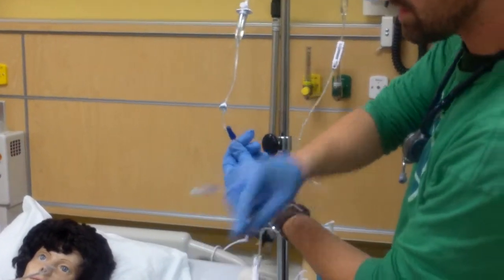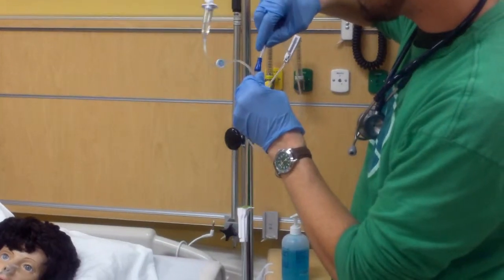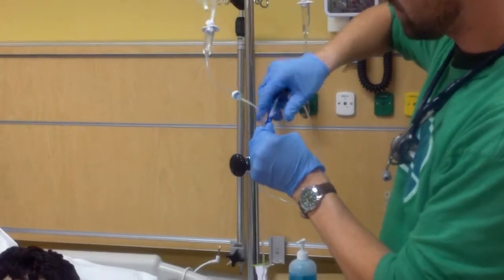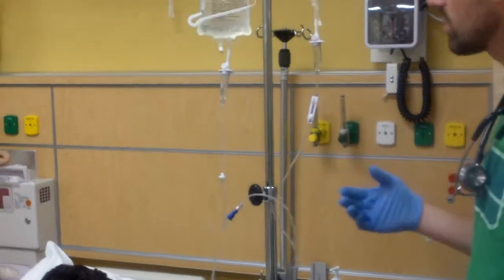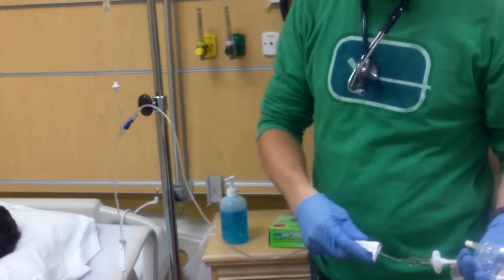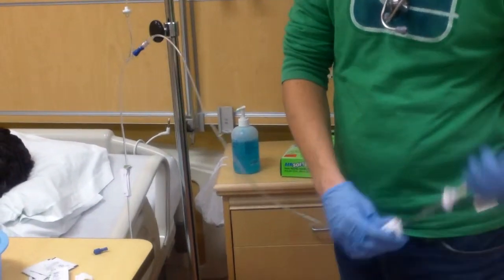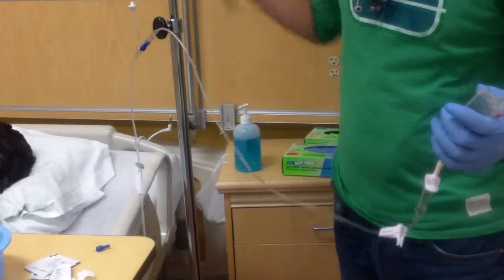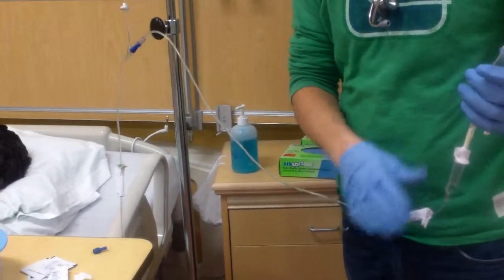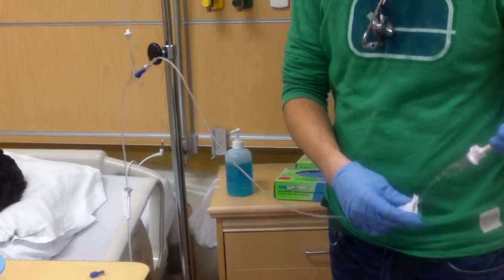Okay, set that down. And then I'm going to remove the cap from there, and then I'm going to just insert it, and then slide my cover right over there and give it a twist. So they're connected. Now I need to prime my secondary line. So I'm going to take this down. Alright, I'm then going to release this clamp, and then I should, there we go. So that's good. There we go. Now she's going. Let me make sure there's no air in it.